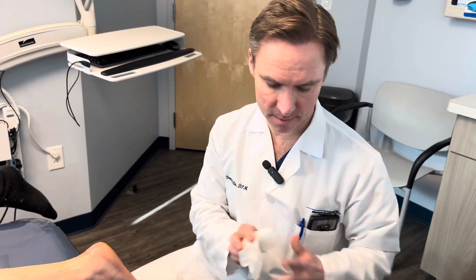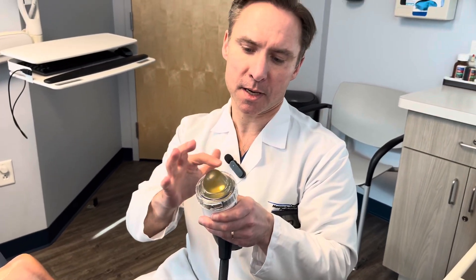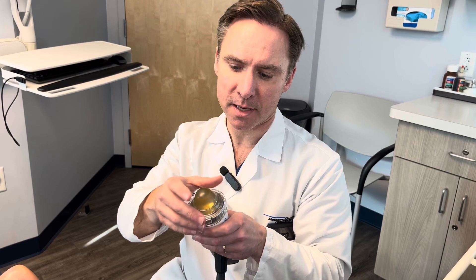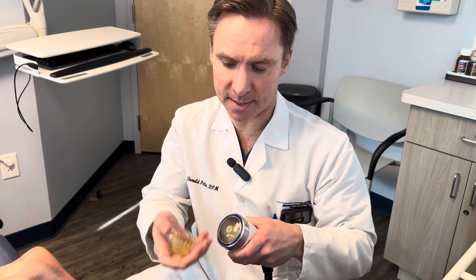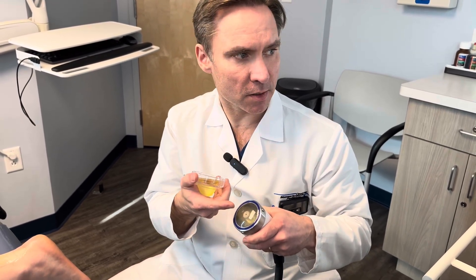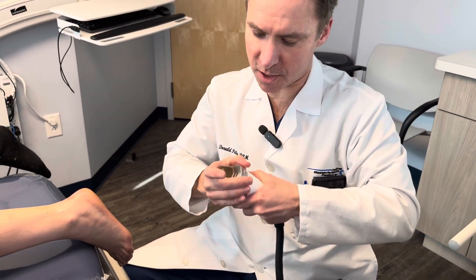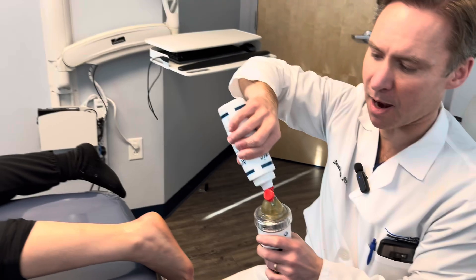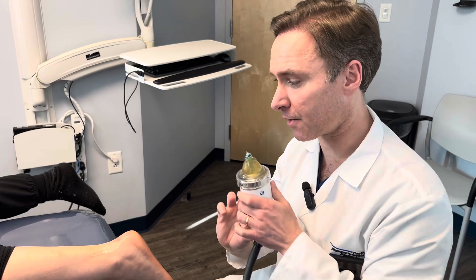After that, I will do the focused shockwave. This is the focused shockwave with a tall standoff, which means the focus is going to concentrate down into a point right about here. Most things we do in the foot and ankle are close to the skin. Every morning the staff puts a little EPAT oil on it — just a small dab, because too much will drain on your pants. With the focused shockwave, you don't move it around as much. You want to use an area about the size of a quarter, or don't move it at all.